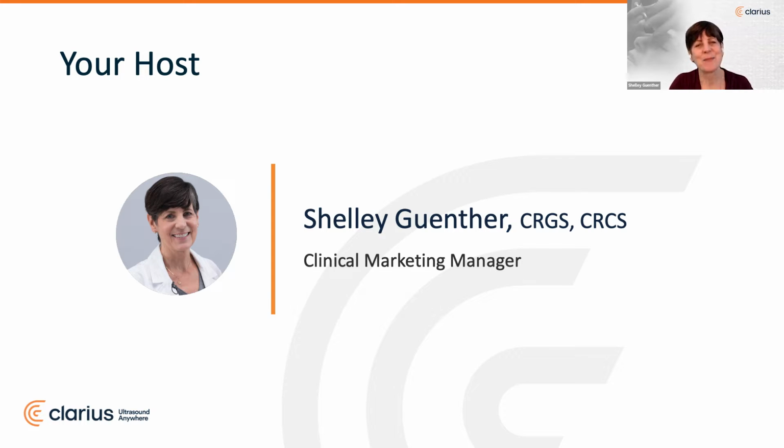I'm really excited to be welcoming Dr. MJ back for another content-rich and informative webinar about the most common complications she sees in her practice. If you're fortunate enough to have ultrasound in your practice, you may already be familiar with imaging of existing fillers. And if you're new to ultrasound, you'll see that it's actually not that difficult to locate and identify fillers, and treating them is very achievable for anyone who may encounter a misplaced filler.